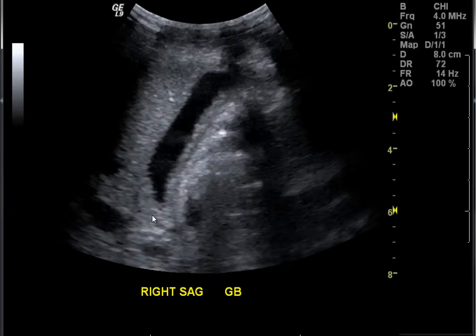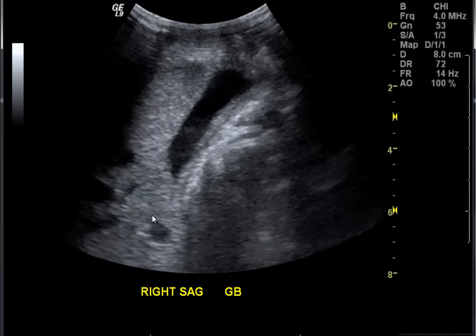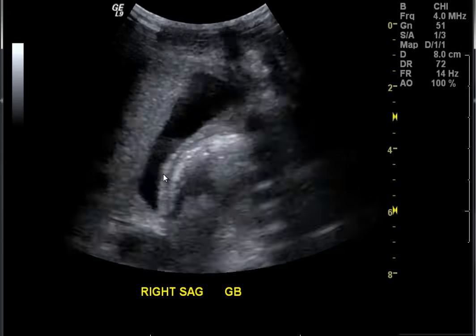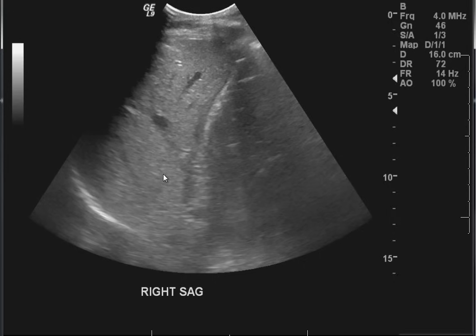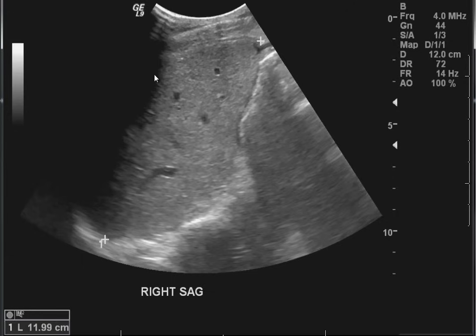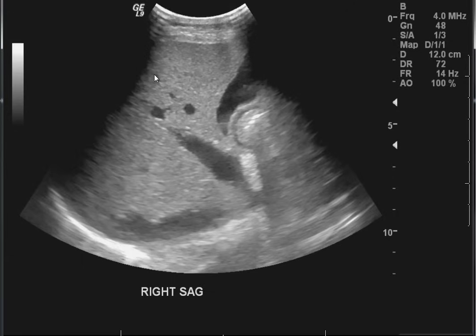They managed to clear the gallbladder. They may have dropped their gain a little — they went to 51. One thing to remember is the liver is at risk of becoming fatty infiltrated. When the liver is fatty, it is more echogenic than normal. You can see some of these artifacts again entering into the gallbladder from the outside in.